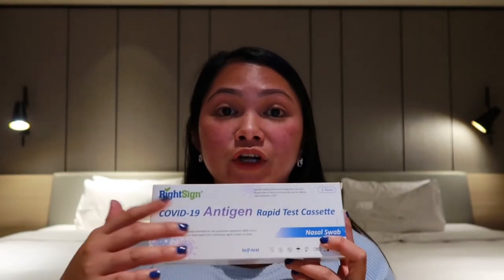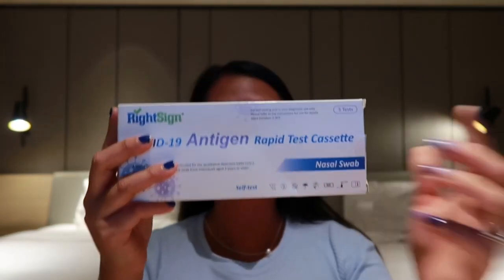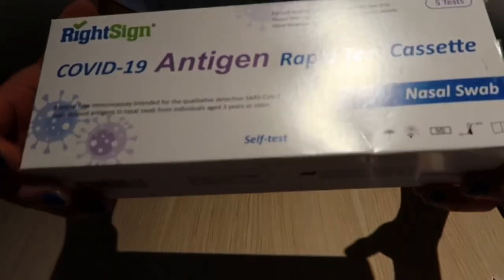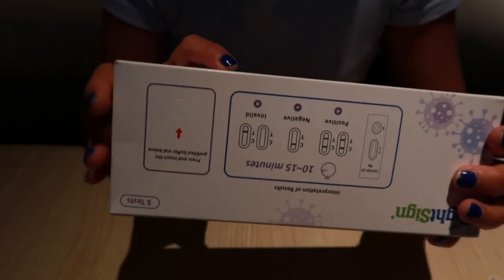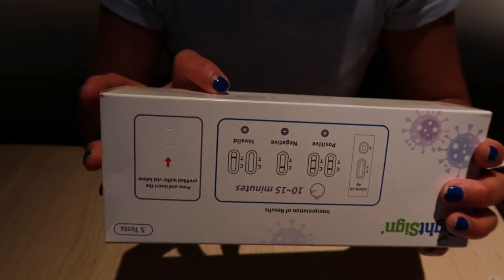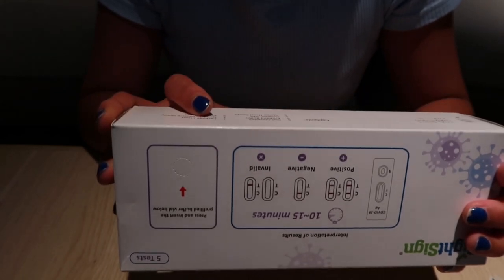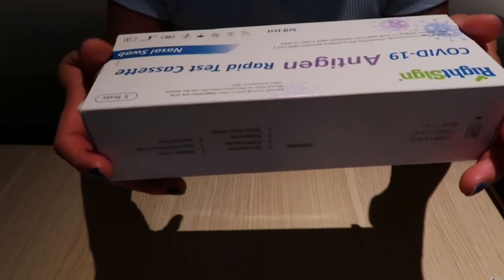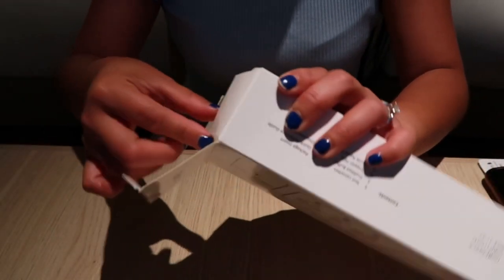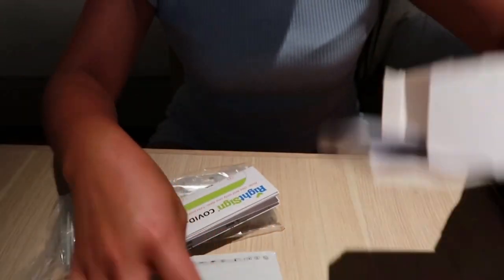If you're in Australia, I bought it from Kami's warehouse and the shipping was free. So let's check it out! This is the box. Inside it has five test cassettes, five buffers, five droppers, five sterile nasal swabs, a package insert, a quick reference guide, and five disposable bags.